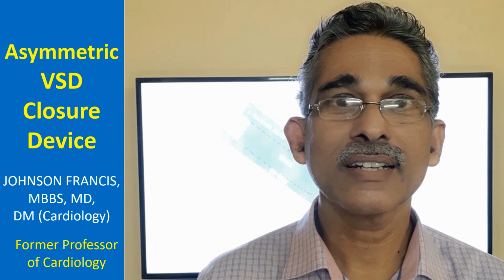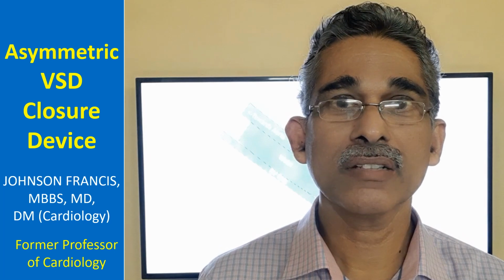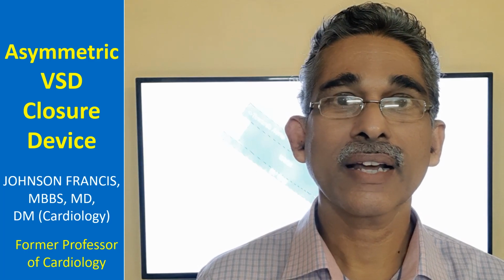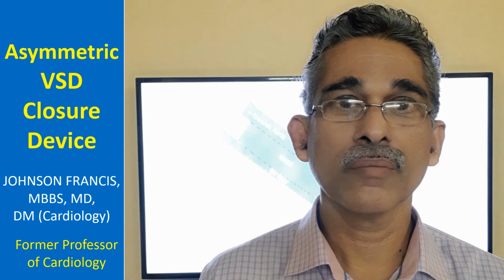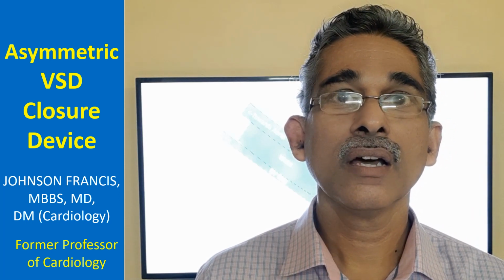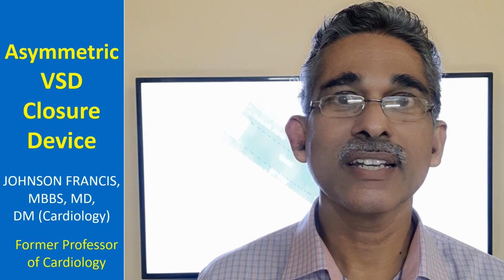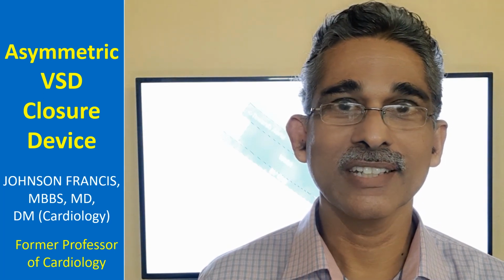For these reasons, closing with a device, and for that matter with the surgical closure also, there is a risk, it is more likely to produce conduction disturbances and aortic valve injury. So that is why it is not that popular. Still, there are some devices which have been developed known as asymmetric VSD closure device for perimembranous VSD.